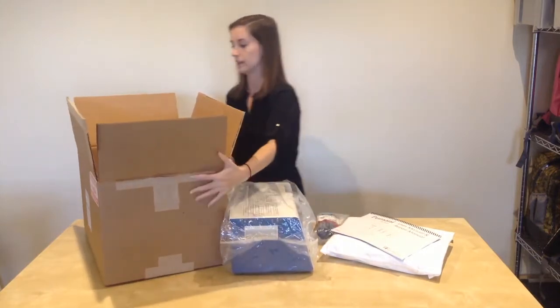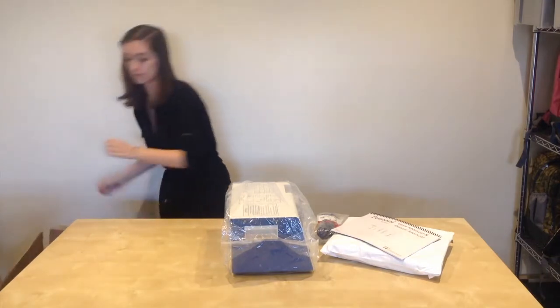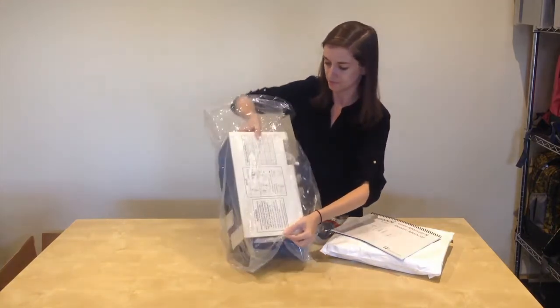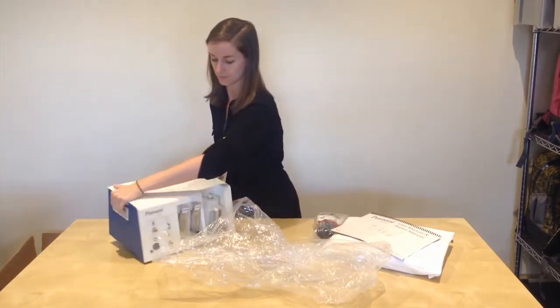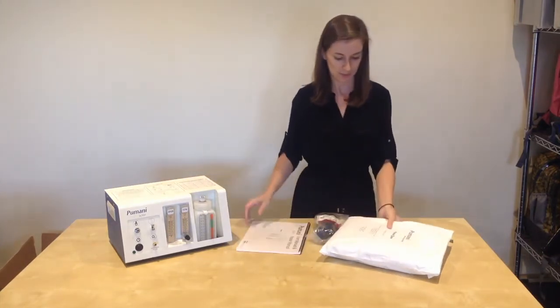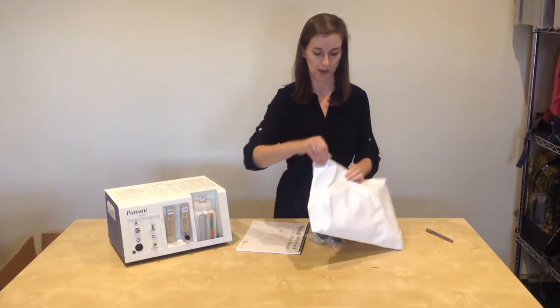Set aside the box and remove the plastic covering over the Pumani unit. Set the covering aside, and I will now explain the contents of the accessories pack.